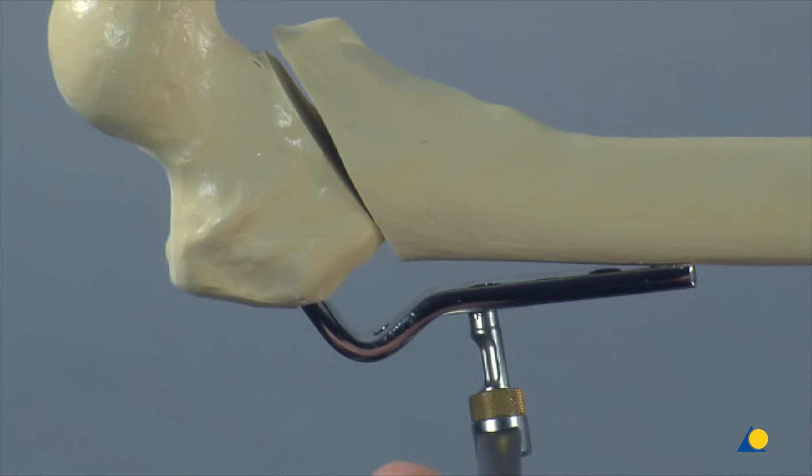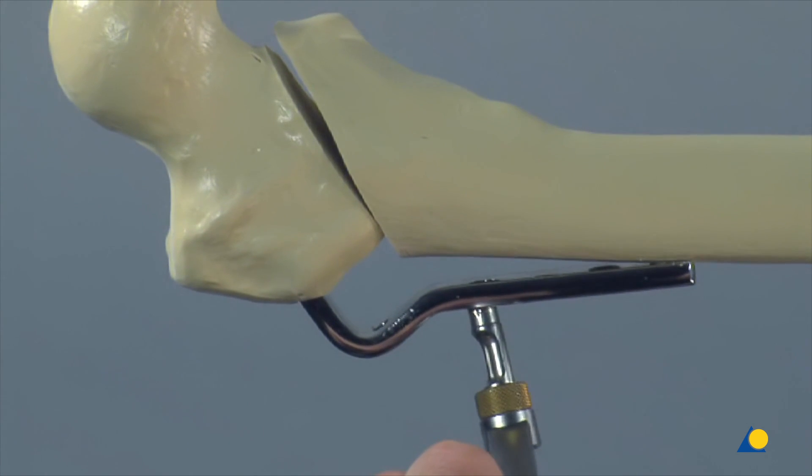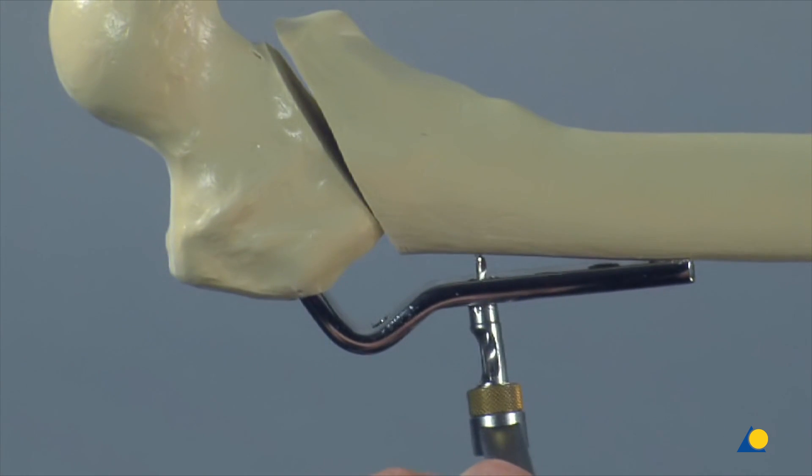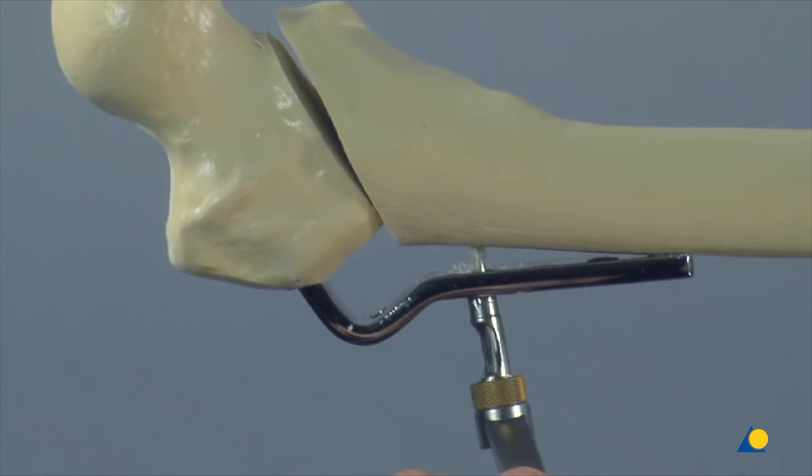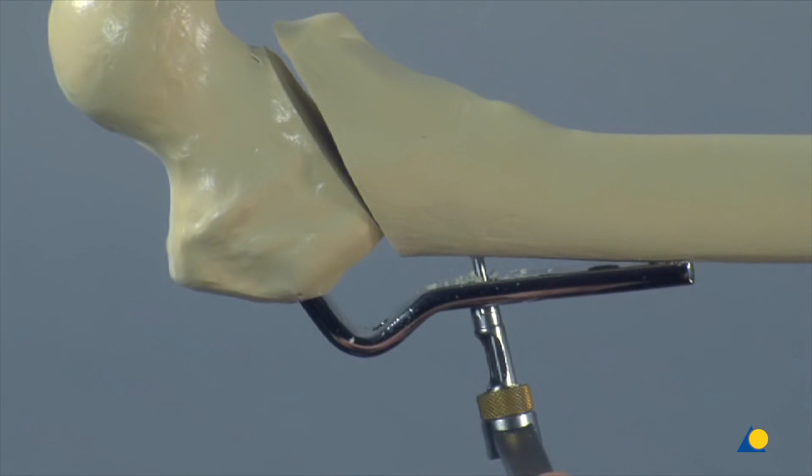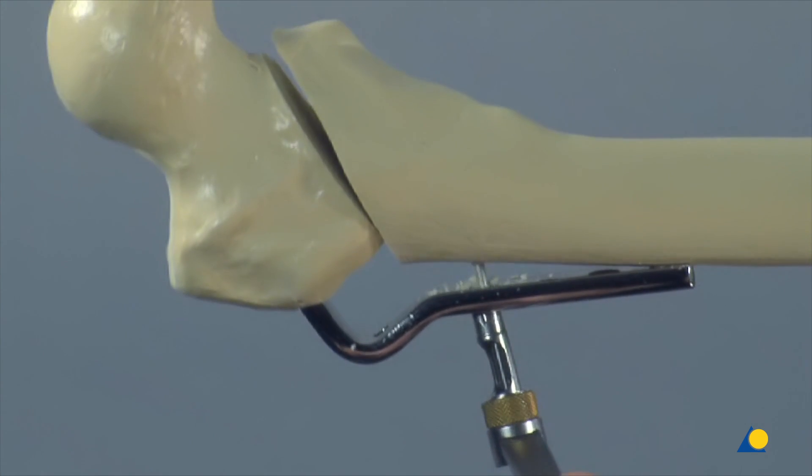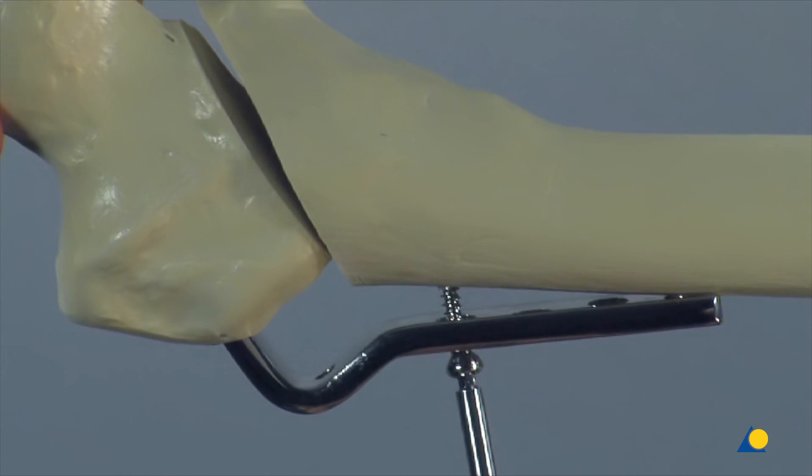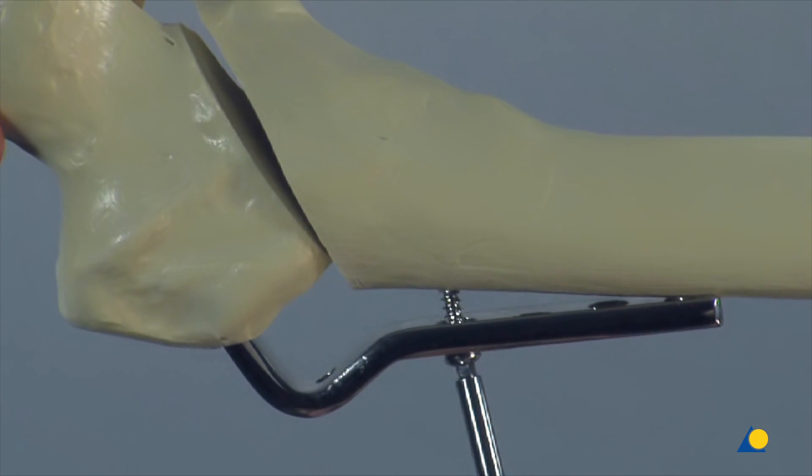A screw hole is now prepared through the proximal plate hole using the yellow eccentric DCP drill guide. As the plate has previously been left about one centimetre proud of the bone, when the screw is inserted and tightened, the plate is drawn to the bone.